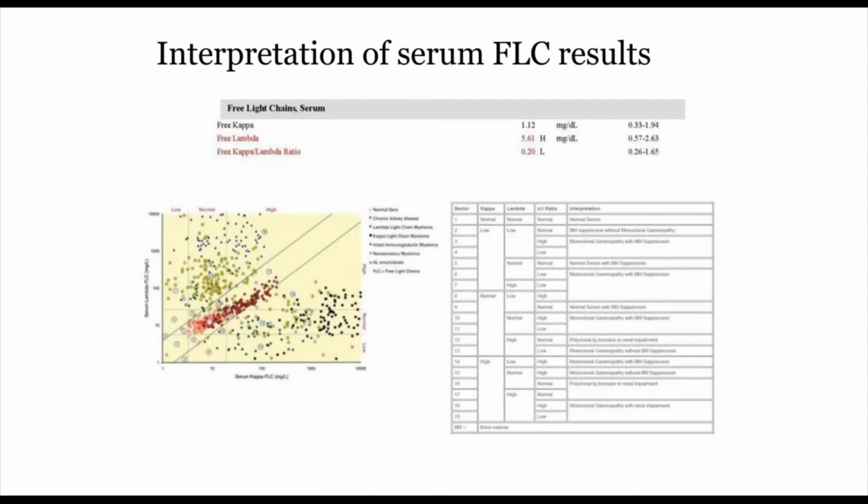And so I think it's very important for clinical labs to do their own validation, both using clinical specimens as well as healthy donors, and also work with your clinical staff, the people who see the patients, so that there's no misunderstanding when you switch assays, where the clinicians notice, hey, there's an uptick in the number of abnormal patients. We don't know what's going on. So that's one thing that I would like to put out to the laboratorians out there.